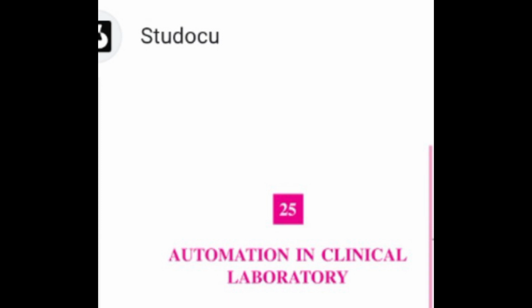Sample identification: the sample label is affixed to the sample collection tube. When blood is drawn, the sample on reaching the laboratory is recorded by a computerized procedure. After assessing, the sample undergoes the technical handling process, which requires physical removal of serum from the original tube. A secondary label bearing the same information as the original label must be affixed to the secondary tube.